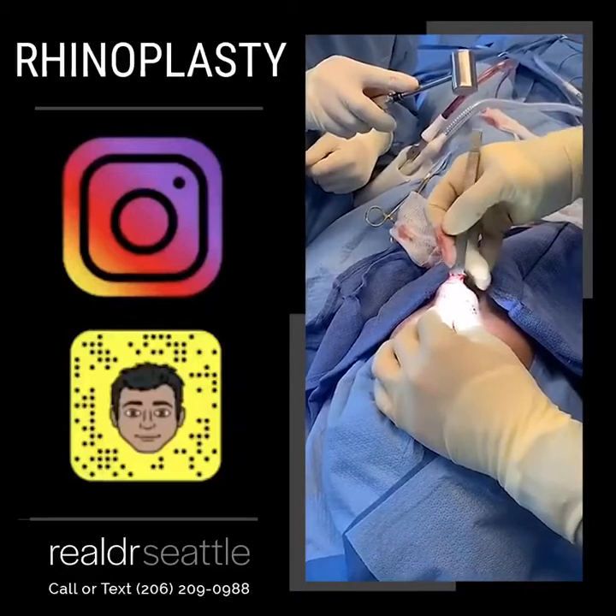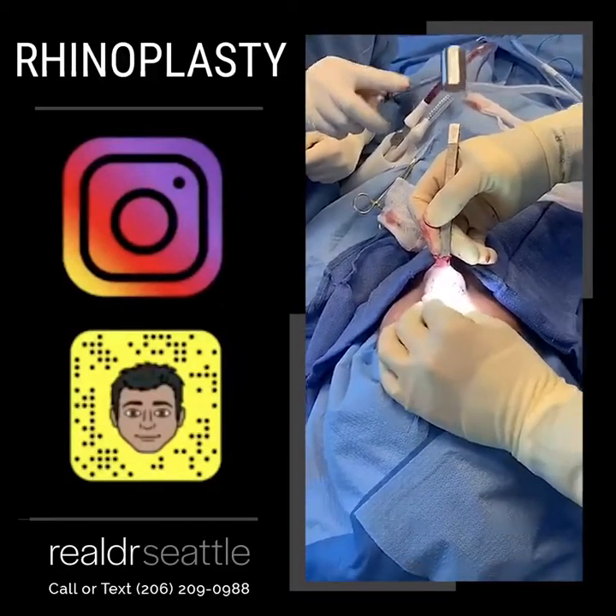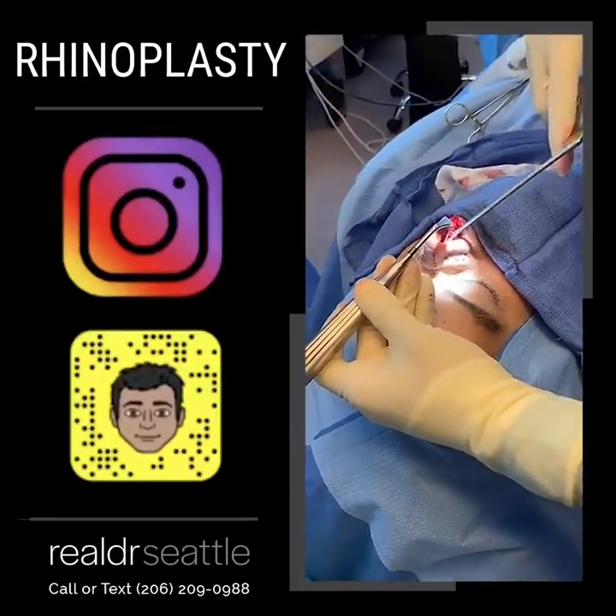Now what we're doing is breaking the hump. We cut the hump with the bone, and now I'm gently separating it from the soft tissue attachment.